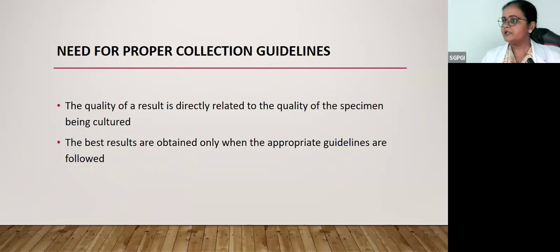Need for the proper collection guidelines. The quality of a result is directly related to the quality of the specimen being cultured. The best results are obtained only when the appropriate guidelines are followed.